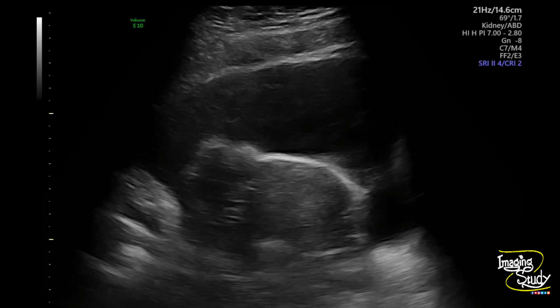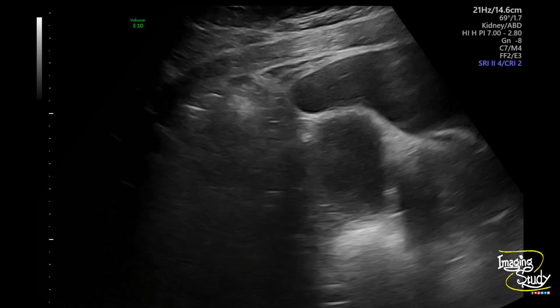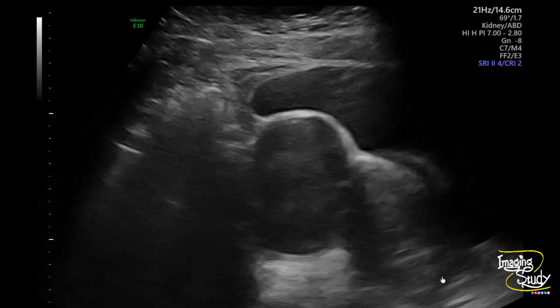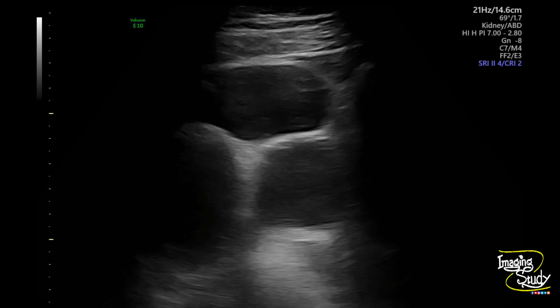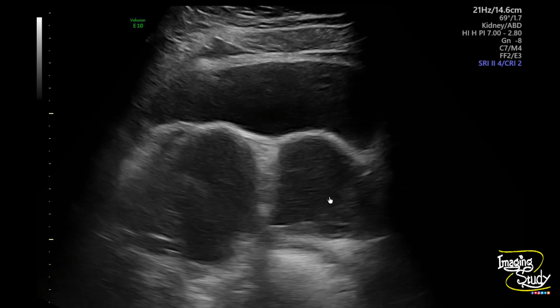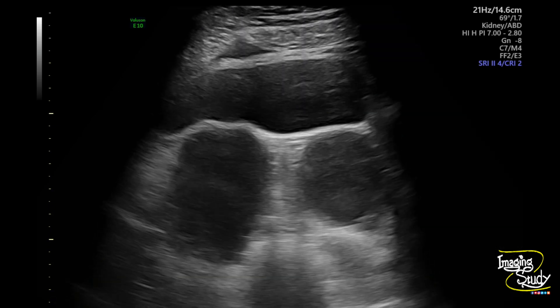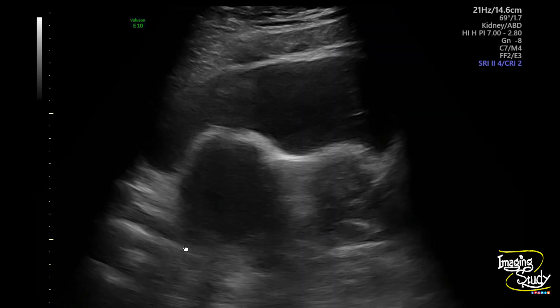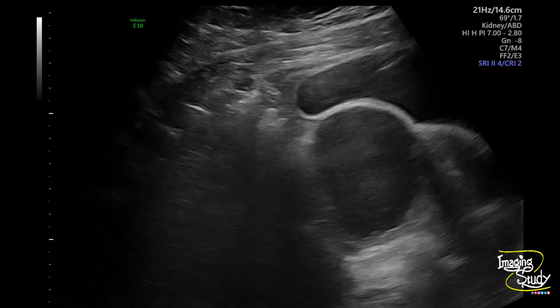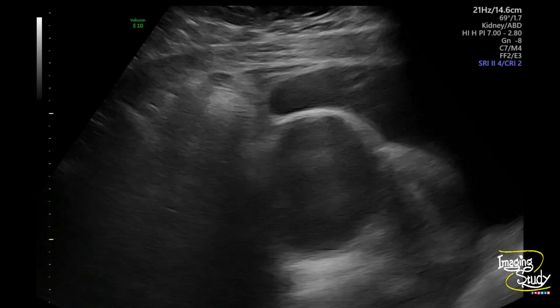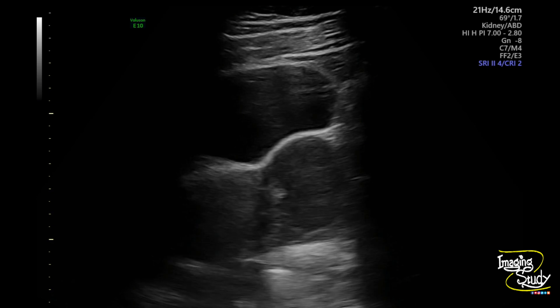Here you can see the transverse section of the lower abdomen. Posterior to the urinary bladder, there are two cystic areas. You can see the uterus in between. This one is the right one and this one is the left one. Both have almost similar echogenicity which is hypoechoic and homogeneous. The right one looks quite larger than the left one. This homogeneous hypoechogenicity with fine low-level internal echoes indicates these lesions to be endometriomas.